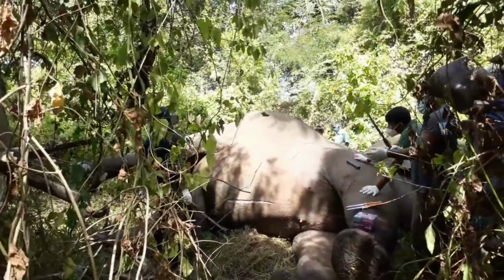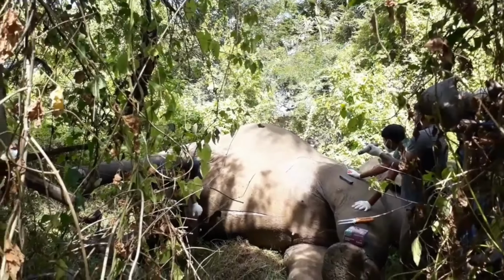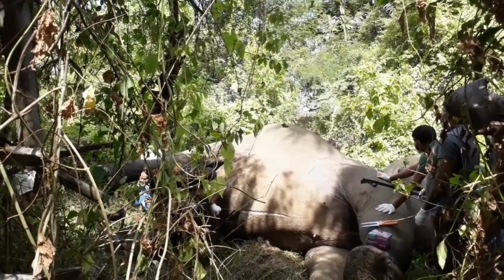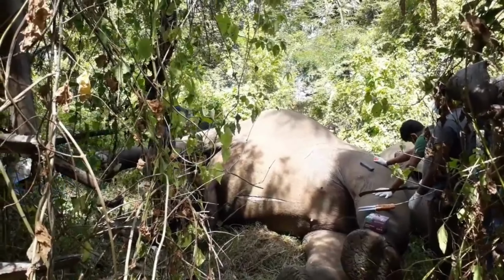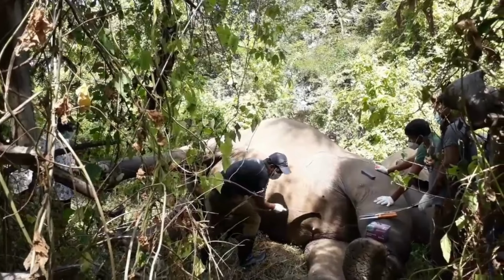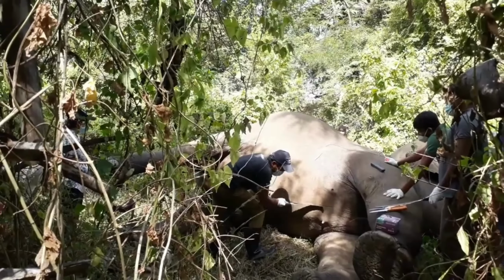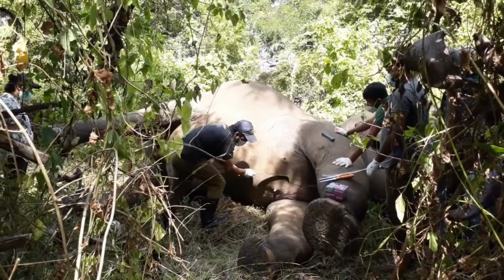Let me start by providing some background. This elephant was found early in the morning, unfortunately already deceased. There were no external injuries or obvious signs of distress, so we're performing this postmortem to determine the exact cause of death. The caretakers had observed nothing abnormal the day before, which makes this case more perplexing. As I begin the examination, the external appearance shows no significant abnormalities.